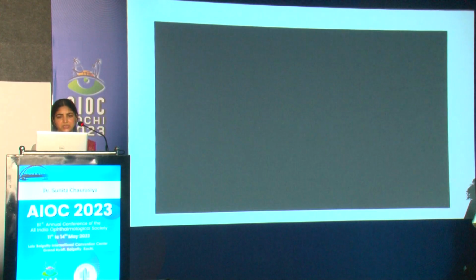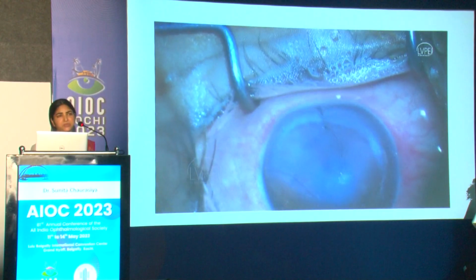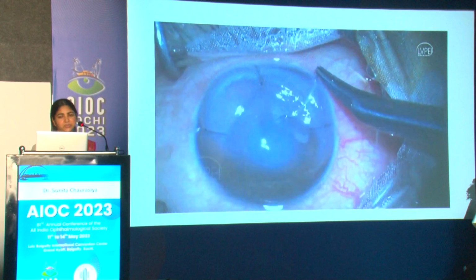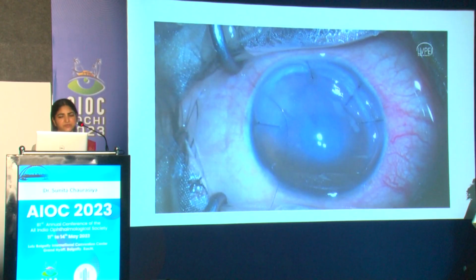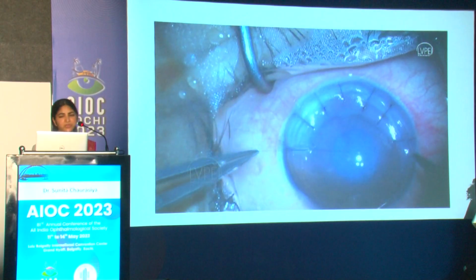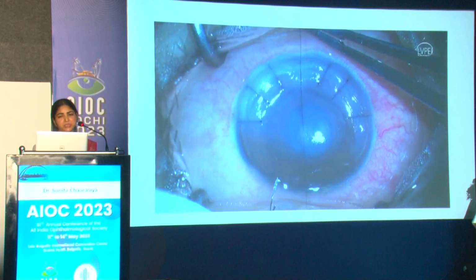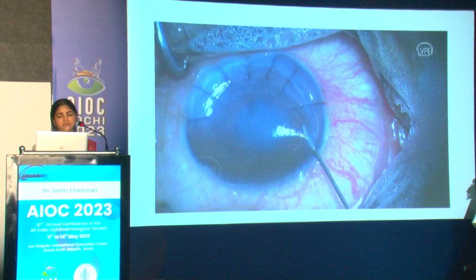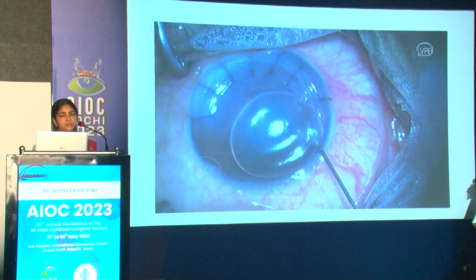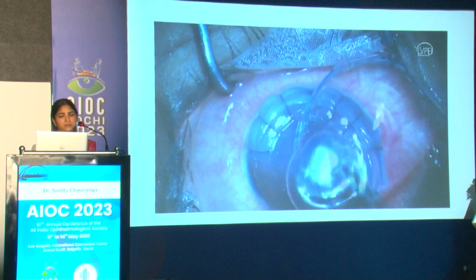So, a similar case of pellucid marginal corneal degeneration. Similar technique. Now in pellucid, the break happens to be crescentric to the limbus, and usually it is either inferior or superior. So here again we make a side port, put a small amount of air bubble, and the sutures are taken radial to the crescentric breach, which in this case is at the inferior location.